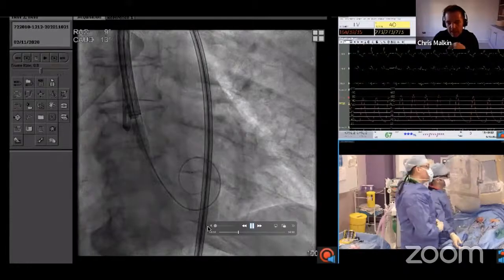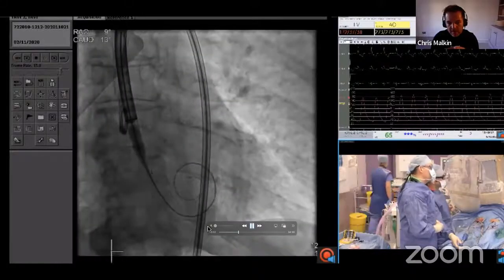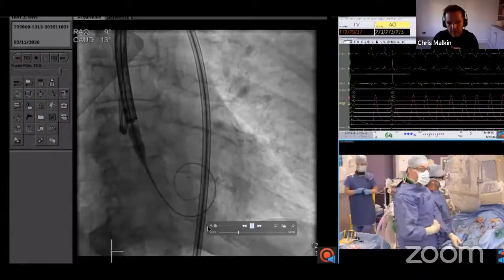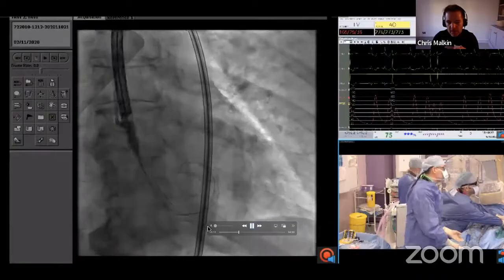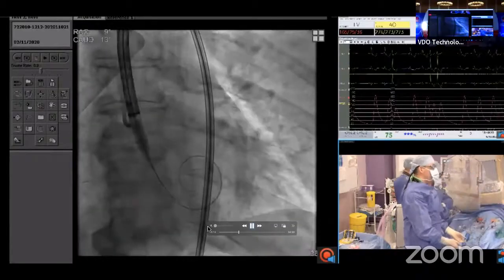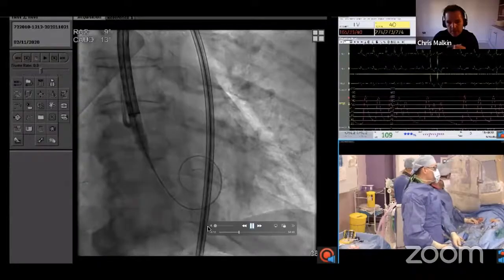Secondly, this case was a bit of a challenge. The lady was so small, 48 kilos, if I remember. She had a very severe radial spasm, and you can actually see that throughout the procedure, the marker pigtail is never perfectly at the bottom of the non-coronary sinus. And of course, that pigtail is the critical marker. So that presented some extra challenges for us.